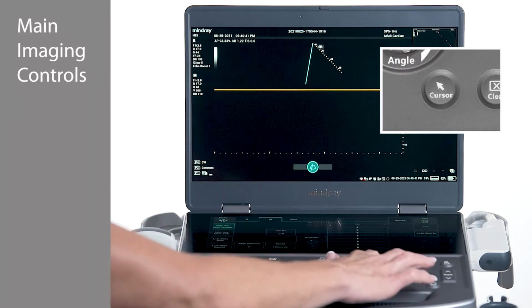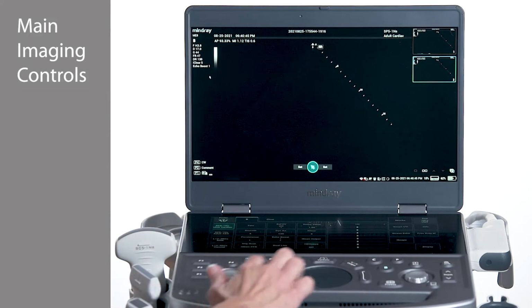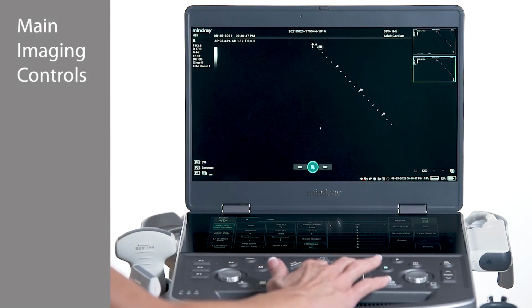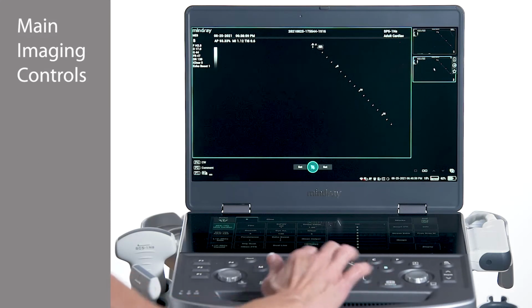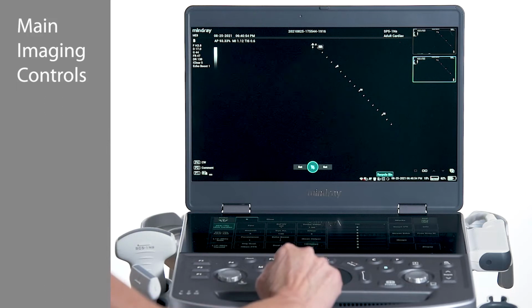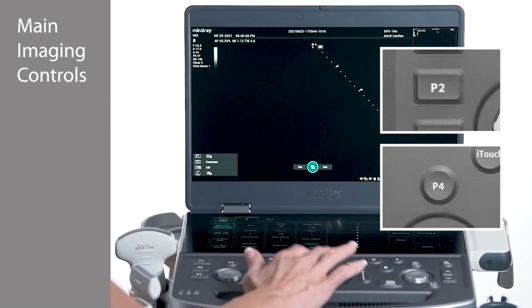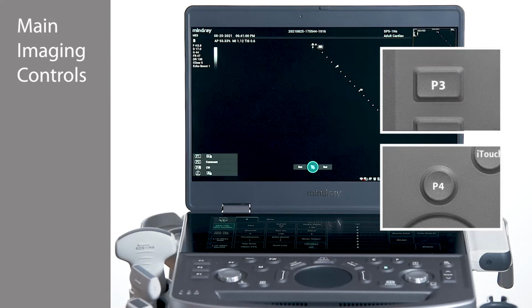On the left side of the control panel, there is a cursor button that will activate an arrow on the screen. The arrow can be used to select thumbnails on the right side of the screen or display functions in the toolbar at the bottom of the screen. The P1 through P4 keys are customizable and will be programmed by your application specialist.